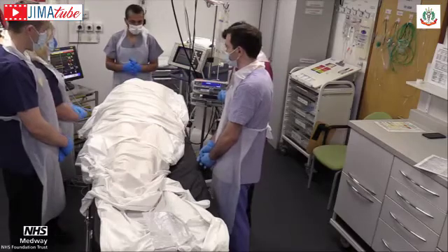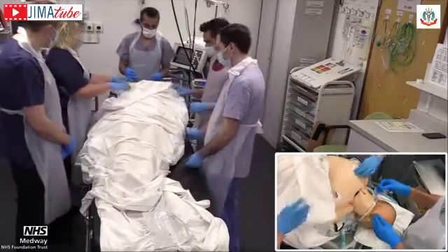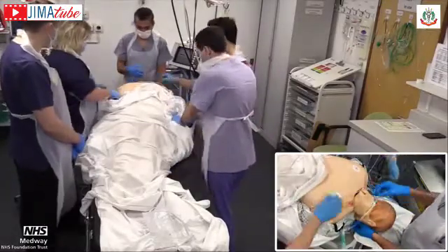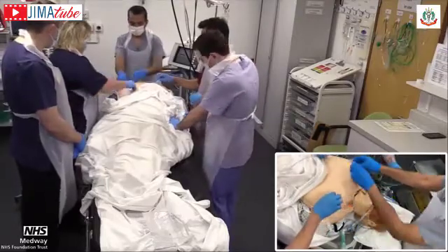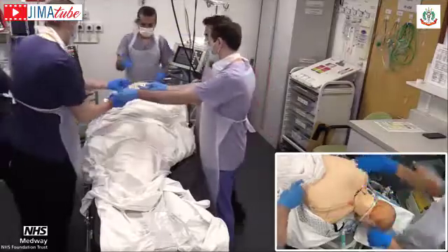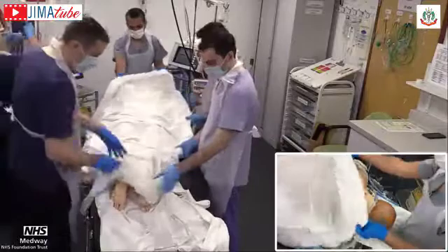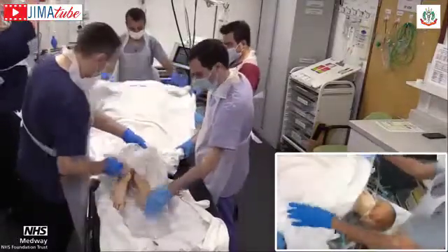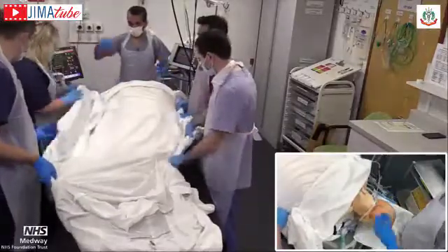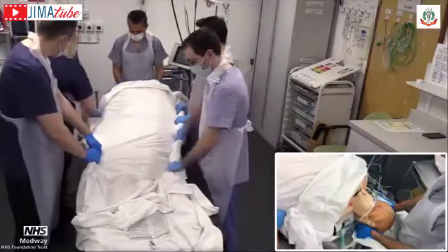So we need to start with our disconnection of monitoring. So we can disconnect ECG and arterial line, keep the end-tidal CO2 and saturation probe connected. And again, take care of catheter to stay in the center and between both the legs. If arms are up, then you have to keep the arms both on the side of the patient.